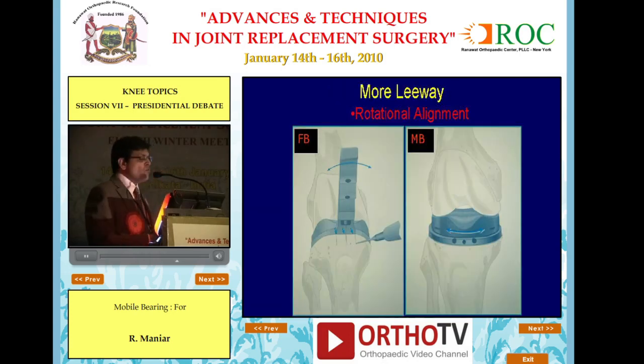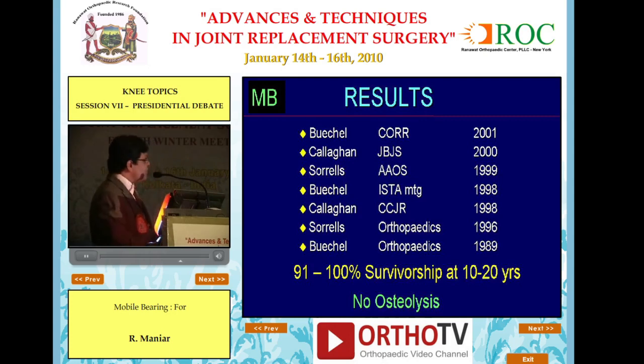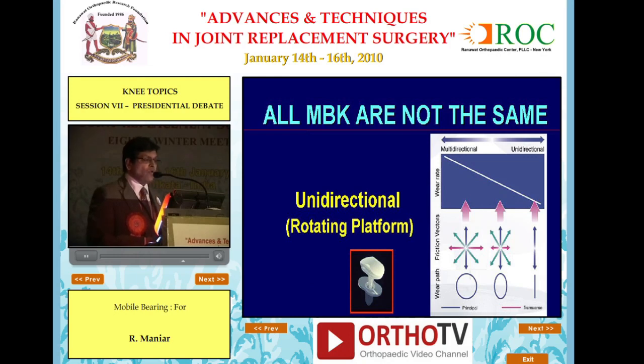In addition, there are some other advantages, like there is more leeway for rotational alignment with mobile bearing knees. Also, if you look at the results of mobile bearing knees so far, there are a number of studies showing excellent survivorship at 10 to 20 years with no evidence of osteolysis. But we must remember that all MBKs are not the same. It is the unidirectional mobile bearing, that is the rotating platform knee, which has better wear than the multidirectional, which actually can have much extra wear.